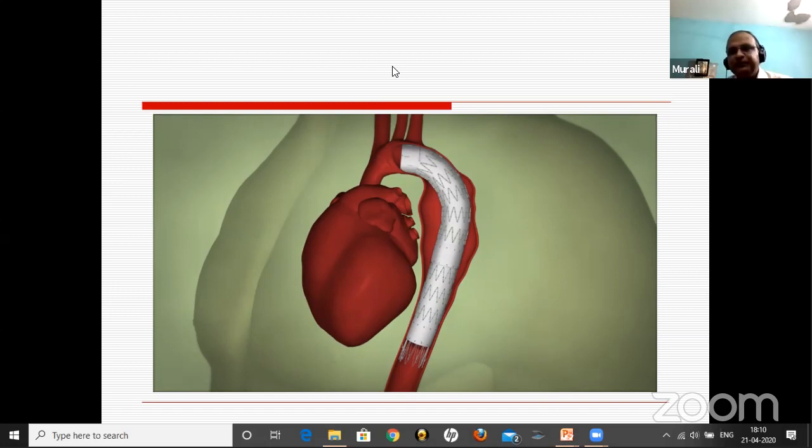Okay. When the patient came for follow-up after 6 months, the candy plug graft had compressed the main graft, and that's why the lumen has become much smaller, but there is flow. So now the question is whether to treat this patient and put, say, a balloon mounted stent in the main graft in the true lumen. Do we do it or not?